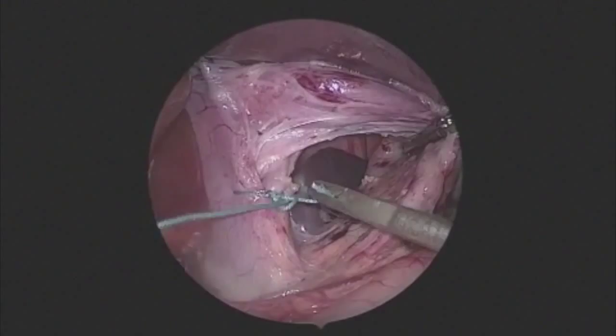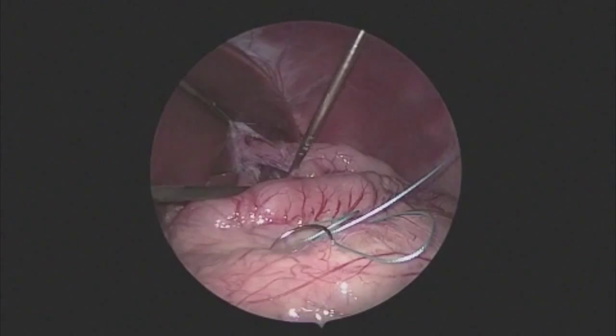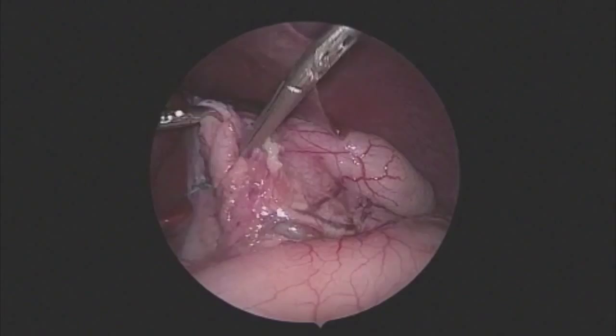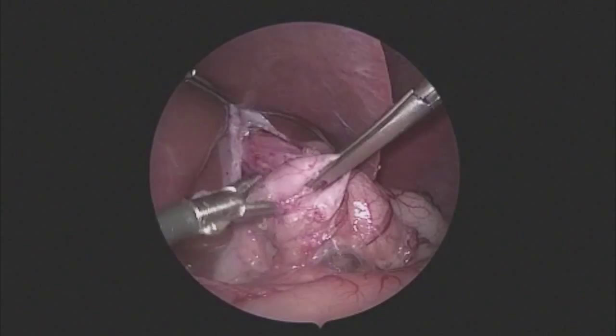With the crural repair done and another stitch inserted, we are now bringing the stomach around behind the esophagus to form the wrap. Because of the extensive mobilization of the stomach — not of the esophagus — the stomach comes behind the esophagus quite easily. We look for the area where we divided the short gastrics along the greater curve, and this is the portion of the wrap we bring around.